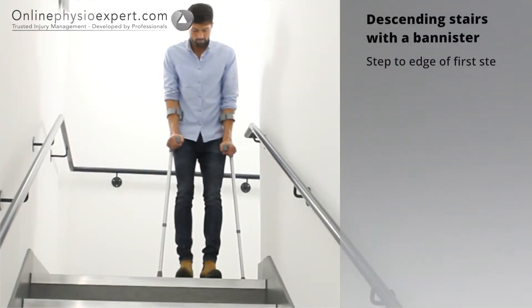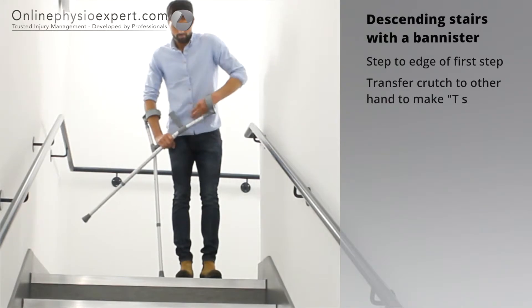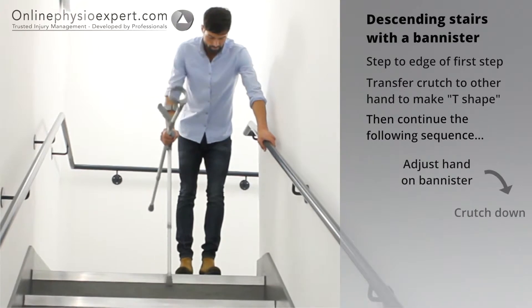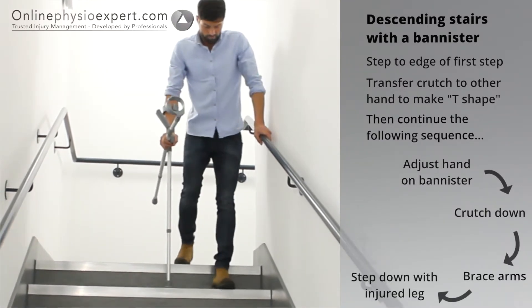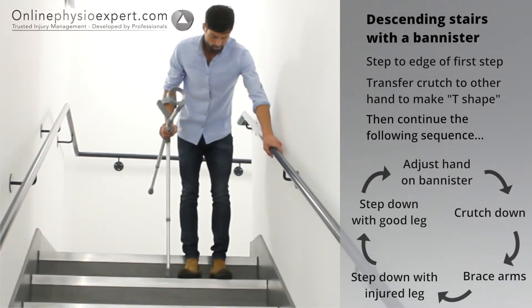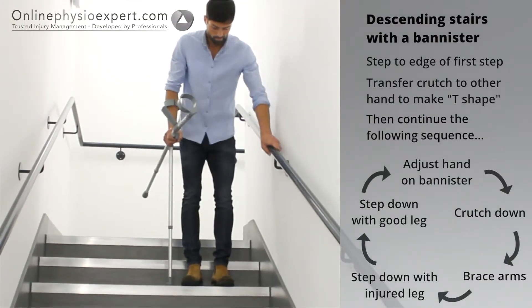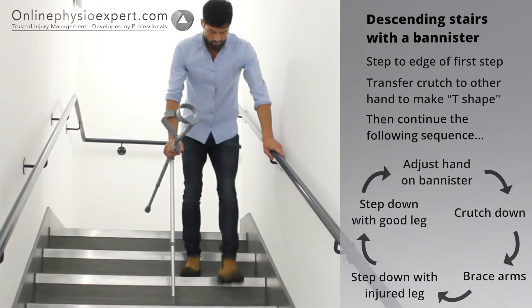To descend stairs safely, step your feet to the edge of the step. Transfer the crutch nearest the banister to your other hand and place your hand forwards on the banister. Place the crutch down to the next step before stepping your injured leg down, followed by your non-injured leg. Repeat these sequence of movements until you safely reach the landing.